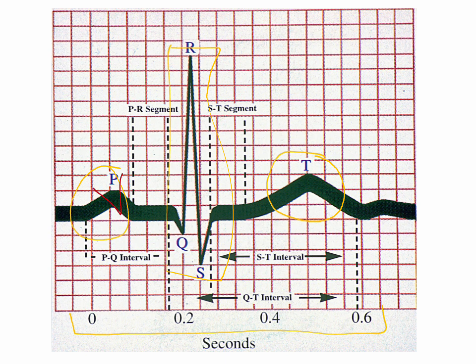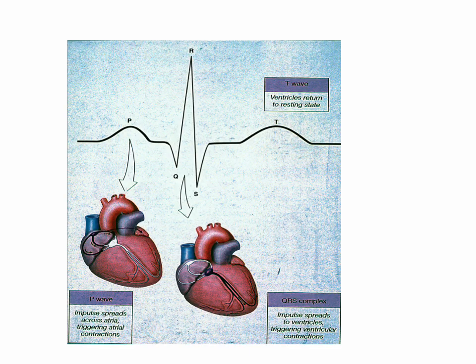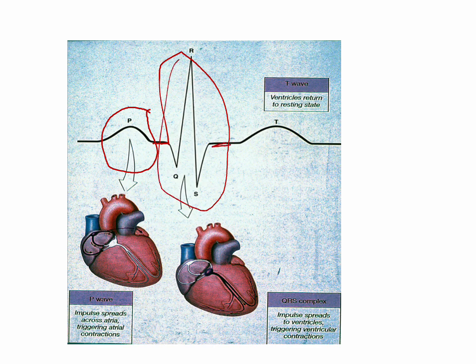Depolarization of the atrium, depolarization of the ventricle, repolarization of the ventricles. Okay? The reason that you guys don't see a repolarization of the atrium is because it happens here and it's not shown. Okay? All right, same thing. Depolarization of the atrium. Depolarization is complete, and then the ventricles are going to depolarize. The depolarization is complete, and then they repolarize.